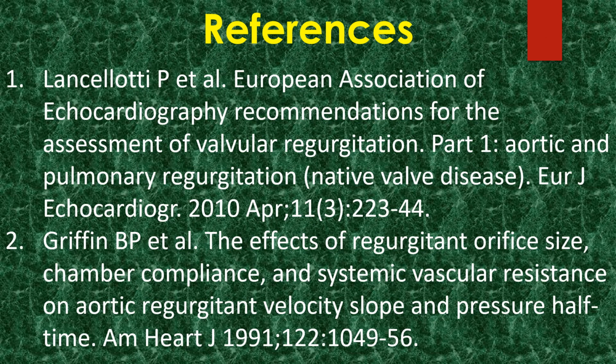regurgitation. Here are the important journal references on this topic.